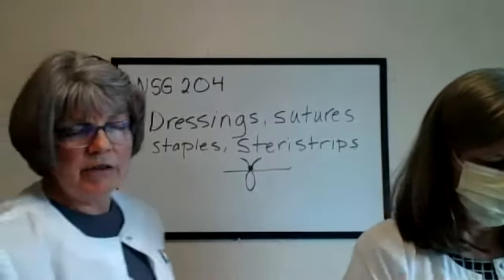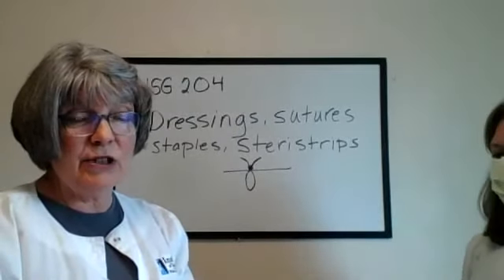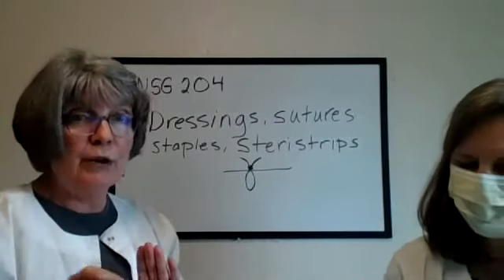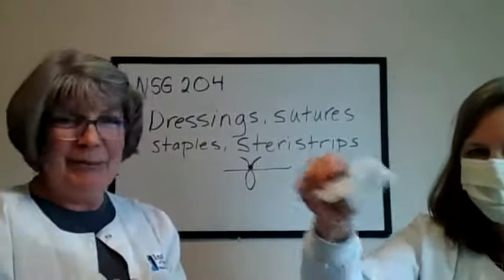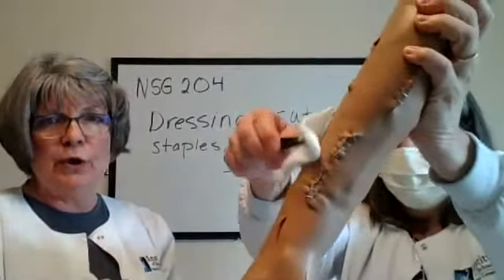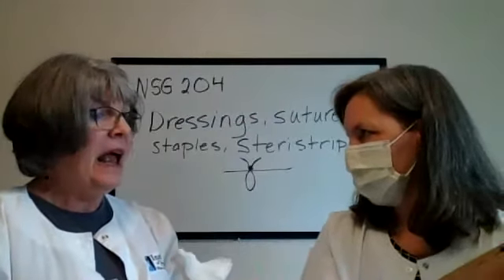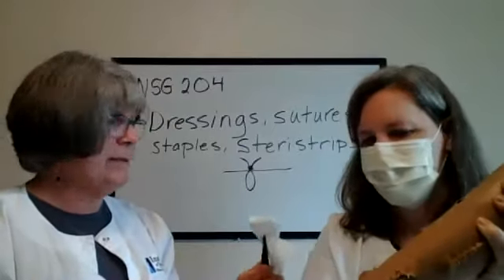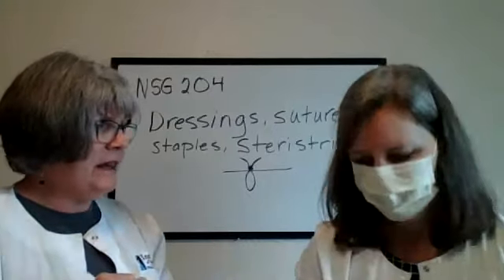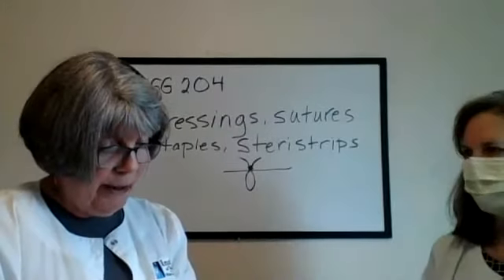And sometimes what you're going to find is there is drainage, like dried serous drainage over the sutures. So sometimes you need to use your little gauze that's in your packet and just wipe over the suture area before you start removing. Alcohol helps too. However, sometimes if there's still some open areas in the incision, it can create some discomfort for the patient, but absolutely.